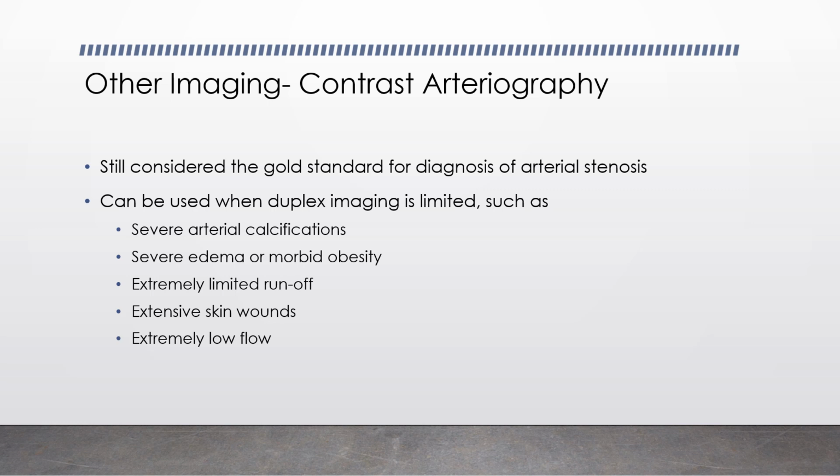arterial stenosis. It can be used when duplex imaging is limited, such as if a patient has severe arterial calcifications that are shadowing out the vessels, if they have a lot of edema or they're obese and they're difficult to scan, if they have extremely limited runoff, meaning that they don't have a lot of blood flow in the vessels, so it's hard to detect and evaluate the vessels themselves.